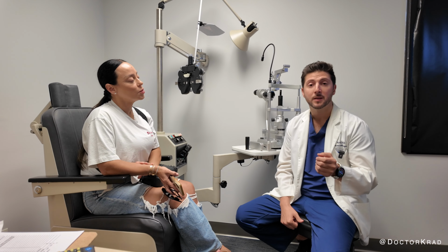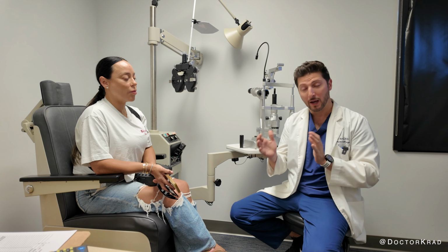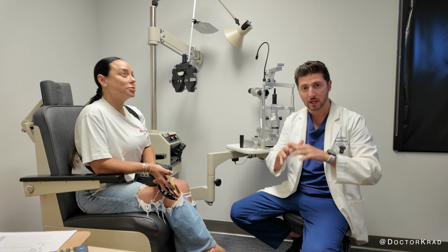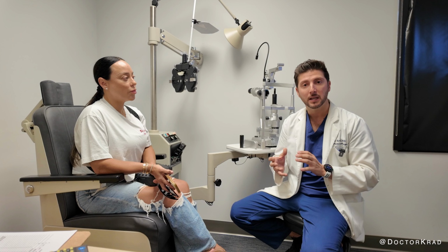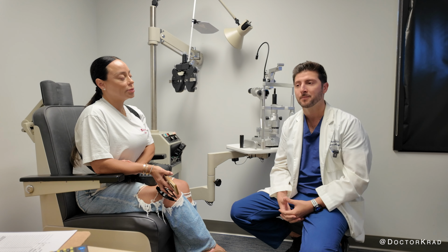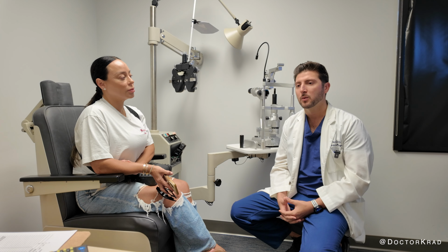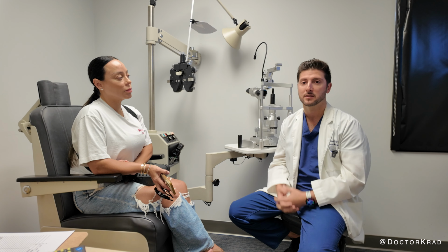So for those of you watching, she had an initial refractive lens exchange. When the lens implant was decentered, they went back again to try to recenter it. They put in a capsule tension ring, tried to recenter it, but she had some bleeding, a little bit of a hyphema, which is blood in the eye, and so she didn't have a good experience, unfortunately. And so we're basically done with trying to reposition a Panoptix lens that wasn't working for her. And so we felt that the safest thing would be to exchange the lens.